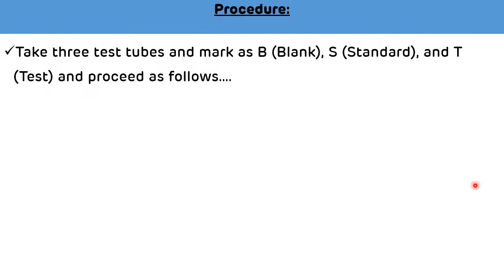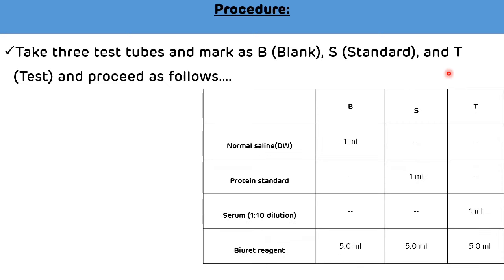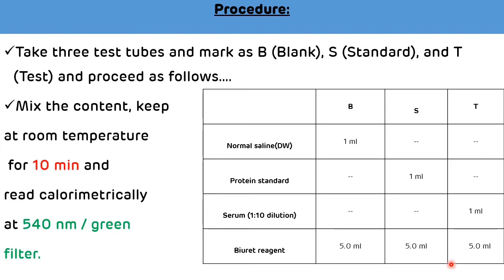Operational procedure: take three test tubes and label them as blank, standard, and test. In the blank test tube, add 1 ml of normal saline. In the standard test tube, add 1 ml of protein standard — concentration of protein standard is 5 g/dL. In the test tube, add 1 ml of diluted serum. Then in all three test tubes add 5 ml of biuret reagent. Mix and keep at room temperature for 10 minutes incubation.